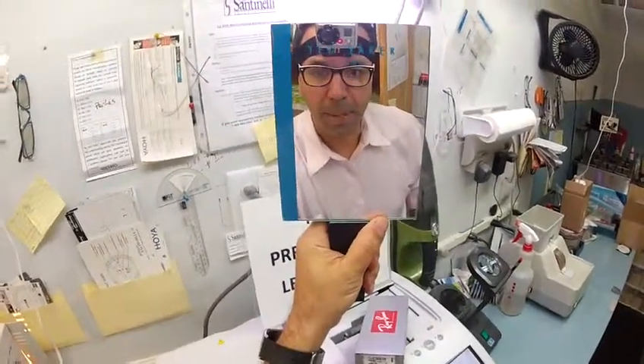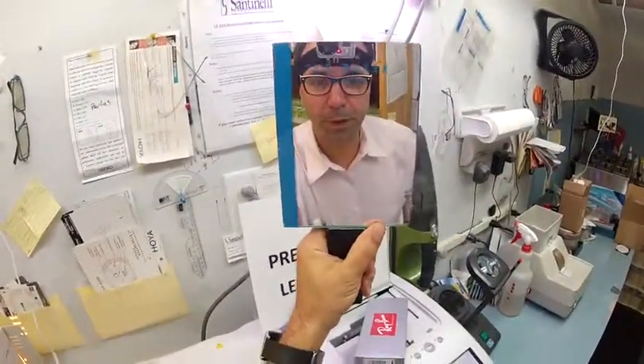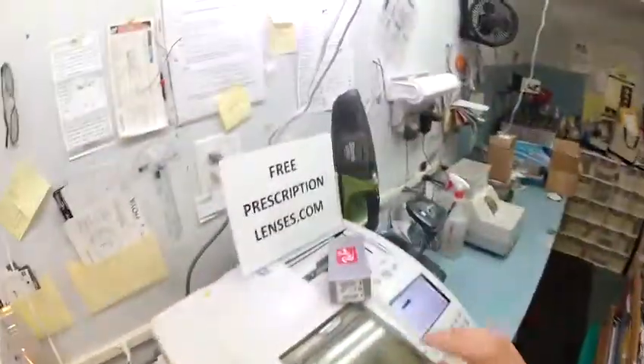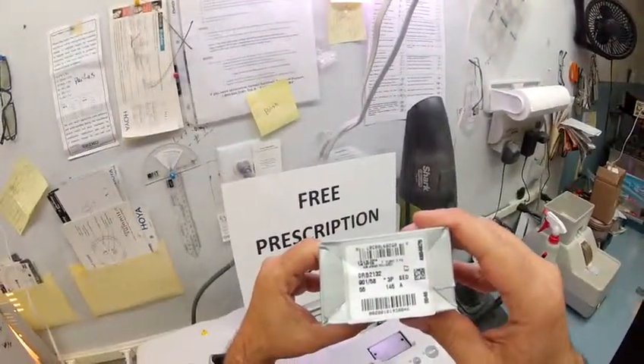Hey Trina in Charlotte, North Carolina, Matthew here with FreePrescriptionLenses.com. First of all, I just want to thank you for your patience while I got this shipped to you. You've been great, you've been super. So here's your video. Let me show you how I cut clear lenses with anti-glare coating for your Ray-Ban 2132 New Wayfarer color 901, the classic shiny black, 55 eye size.